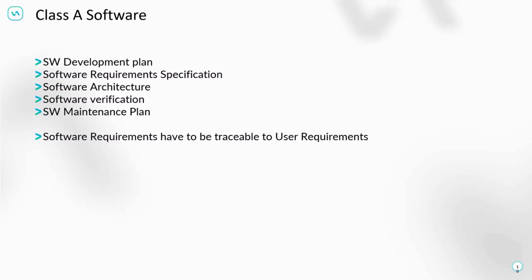You will write the information about the team setup: what kind of qualifications you need, how the qualifications are maintained, what kind of basic knowledge you will need, what your external factors and external documentation are, whether your software is of unknown provenance, which we'll explain later, and how you ensure that you have control over it, the so-called design control sections. That's a software development plan.